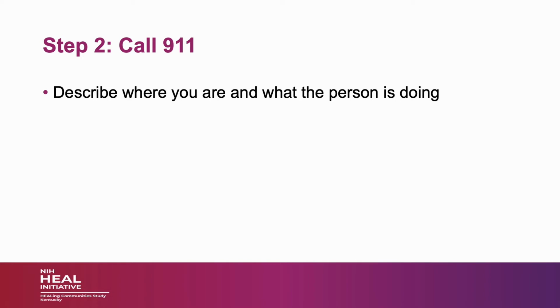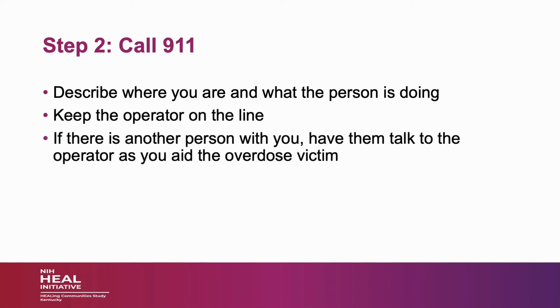Step 2, call 911. Describe where you are and what the person is doing. Keep the operator on the line. They can help walk you through the next steps. If there is another person with you, let them talk to the operator as you start step 3.